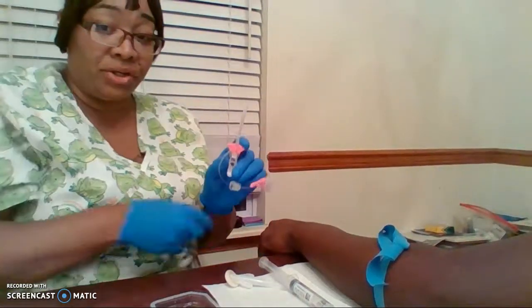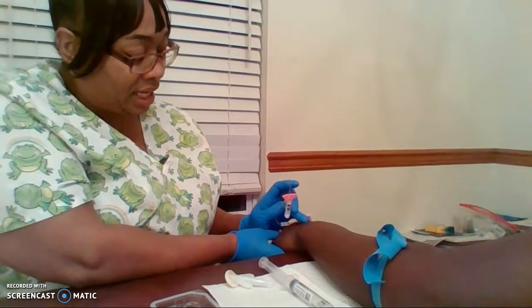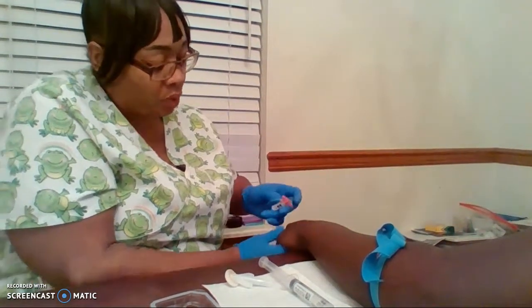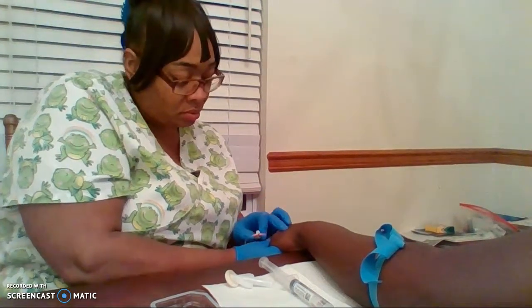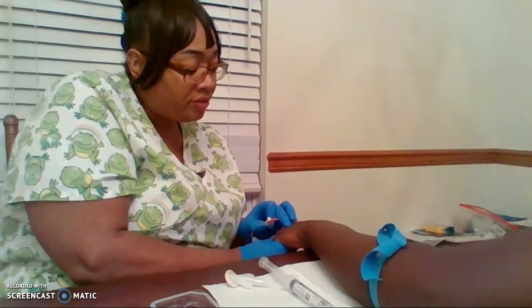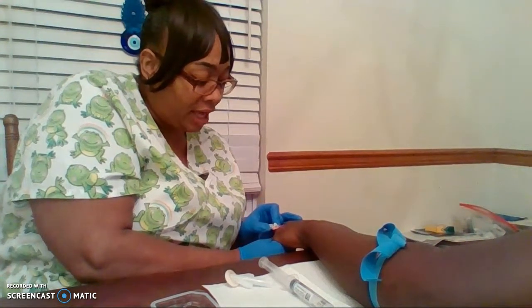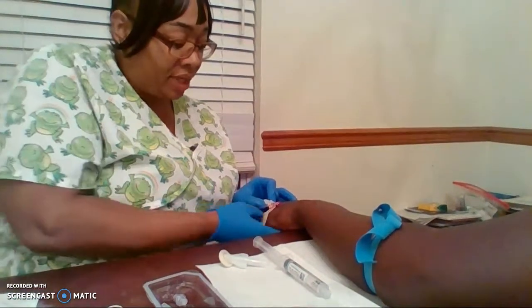All right, so you're going to insert the needle at a 5 to 10 degree angle. Because this is a hand IV, there is little to no adipose tissue available, and you don't have a lot of room for missed steps. Brace yourself, sir. This is going to be a bee sting. All right, you're looking for a flash. And as you can see, there is the flash there.